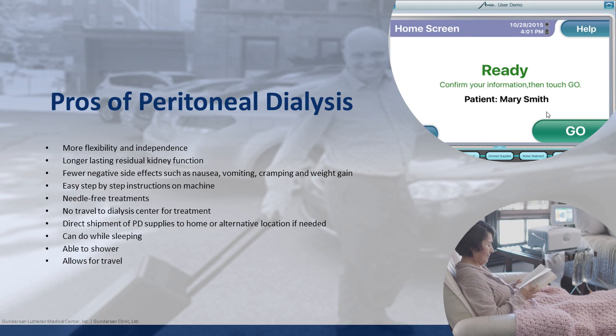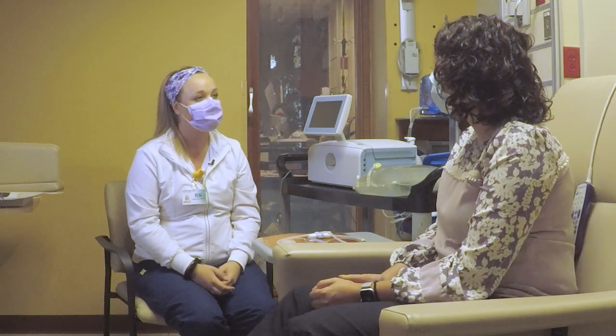Okay. Peritoneal dialysis is also very gentle on the body. We do it daily, so it helps a lot with maintaining your electrolyte and fluid balances, in terms of going on hemodialysis and only being able to go a few times a week where you're pulling off more at one time. Your body is able to handle, and your blood pressures are able to handle this kind of dialysis a little bit better. Good. I guess what are some of the disadvantages of peritoneal dialysis?